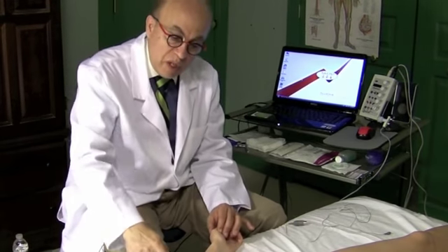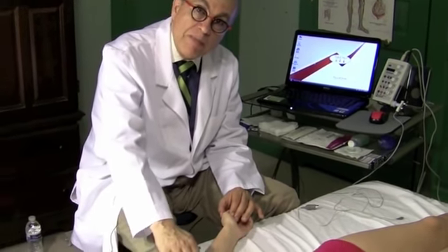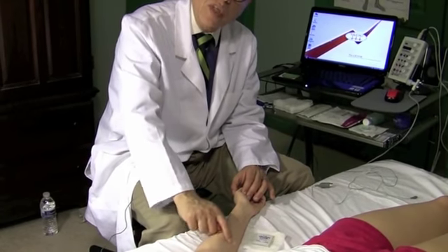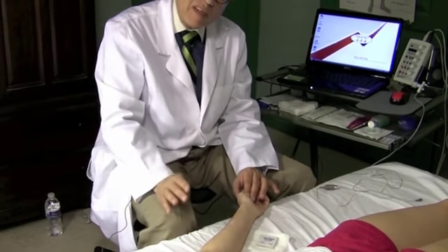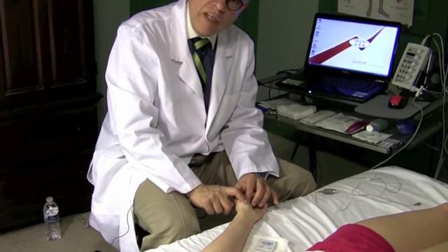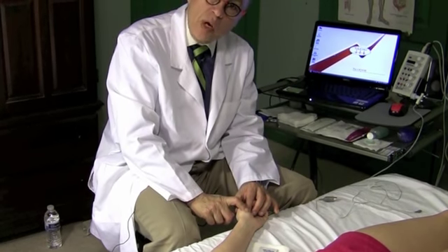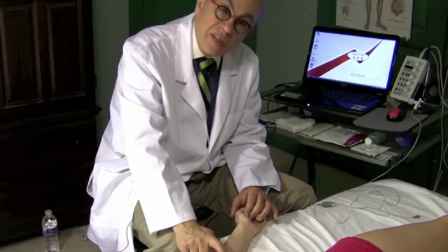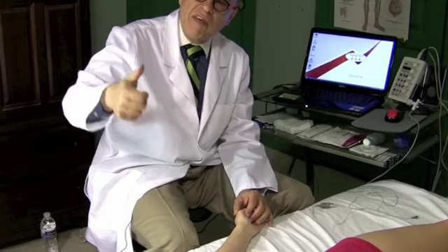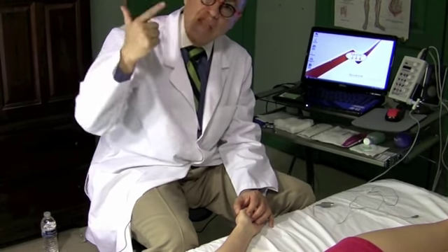For instance, if you have a median nerve lesion at the elbow, I study the flexor carpi radialis muscle, which is a median innervated muscle but coming from C6-7. And then I study the APB, which is also a median innervated muscle, but coming from C8-T1. So if this and this are affected, that means it could be a C6-7, C7-8 and C8-T1 root lesion, multiple levels, or it could be a median nerve. More likely than not, it's a median nerve.